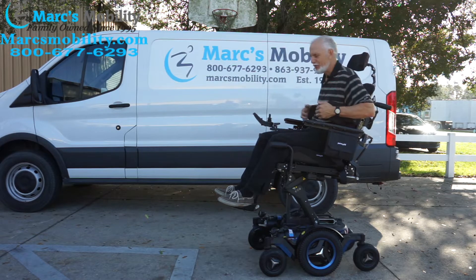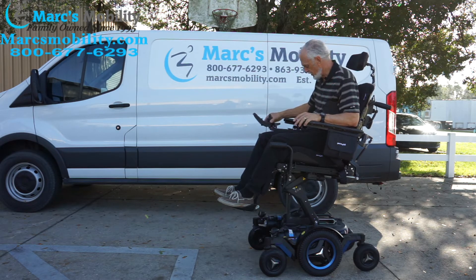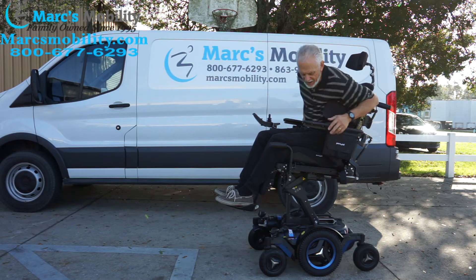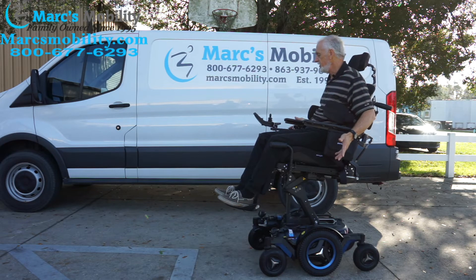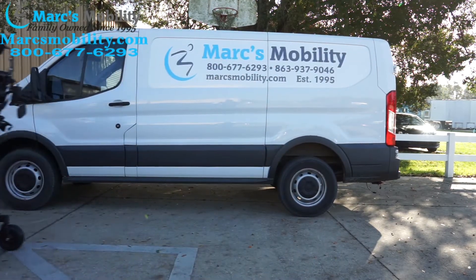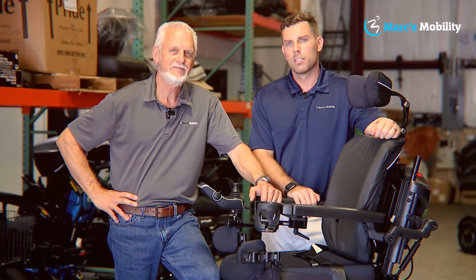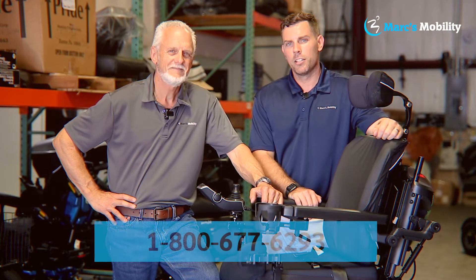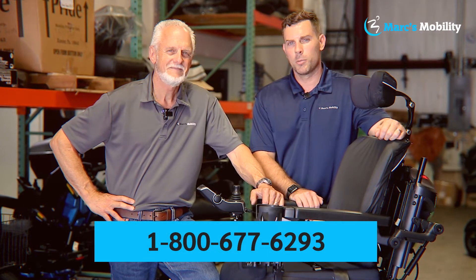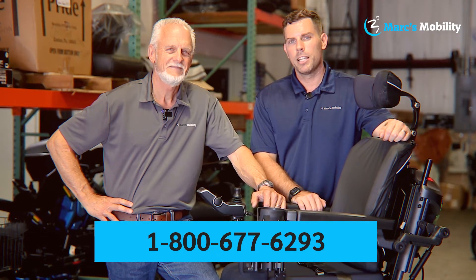This chair is fully loaded: lateral guards, grab bars, push bars, attendant control, swing-away joystick, custom seat belt, bags, full light kit, and suspension. This is the M5 — there aren't too many of these around. I'm Mark and this is Alex, co-owners of Mark's Mobility, started in 1995. We sell many products. If you have any questions, call us at 800-677-6293. Thank you and have a wonderful day.